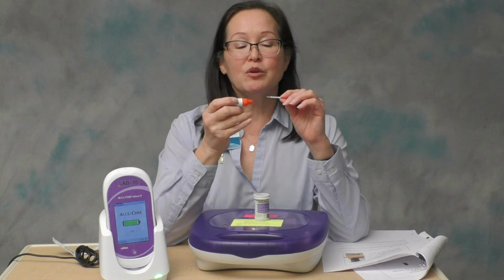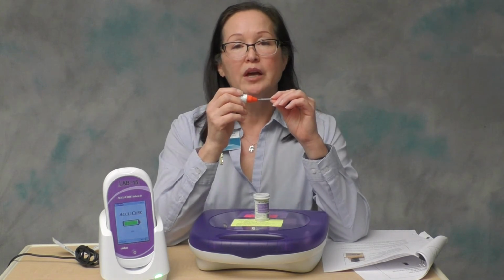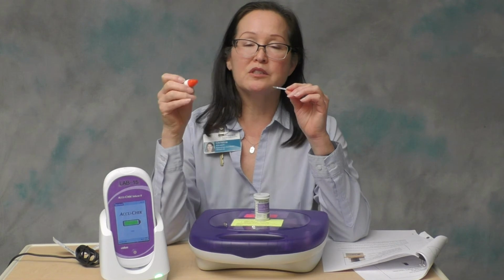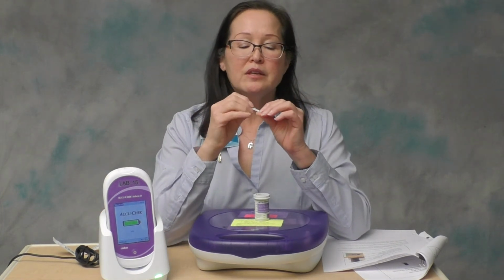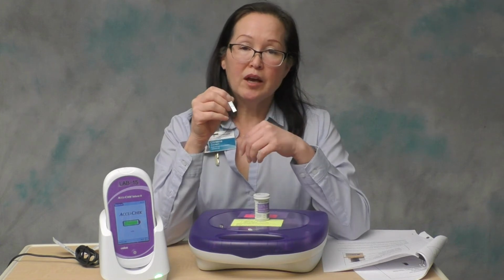So the only way to dose these is to touch the front edge of the strip to the QC bottle or to the drop of blood on the patient's finger, after the strip is inserted in the meter. That's the only way to dose these. The strip goes in with the letters facing up towards you.